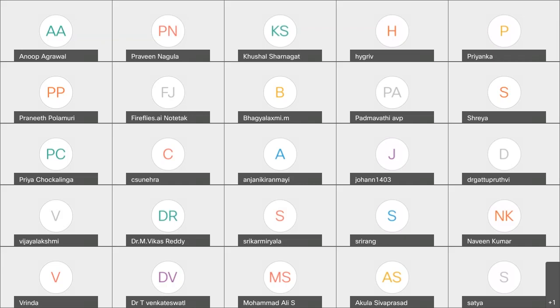The disarray basically means that there is fibrosis and that there is increased volume of distribution by gadolinium. And we are even moving forward by doing something called T1 mapping, which I mentioned last time, where we find that gadolinium actually is less sensitive, and T1 mapping is now going to throw more light into other areas. In fact, this is classically seen in the present patient, while most of the apical HCMs that are imaged have a scar exclusively in the apex. But this patient has something which is moving towards the base. And we are going to see more of this in T1 mapping.